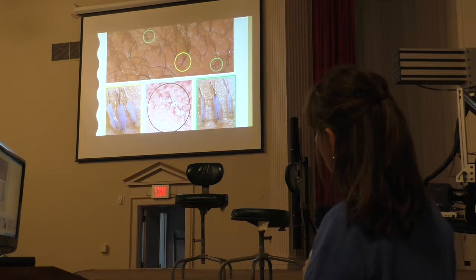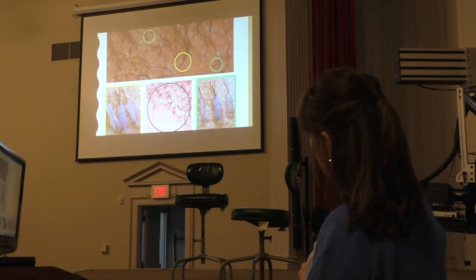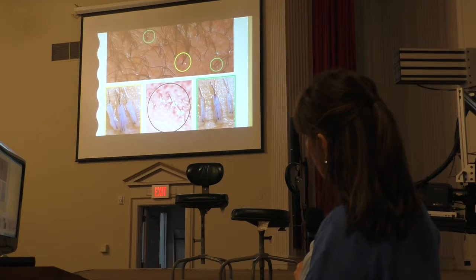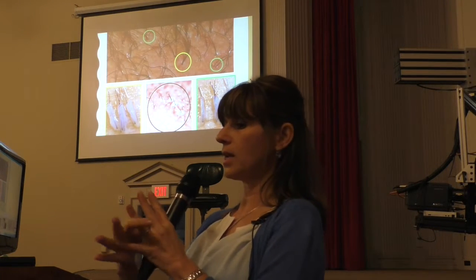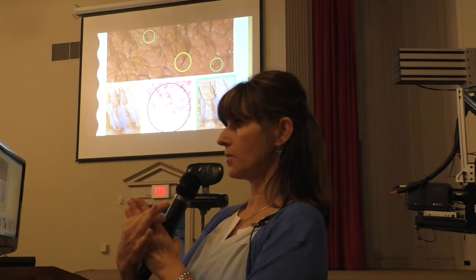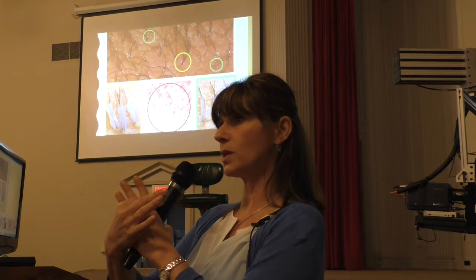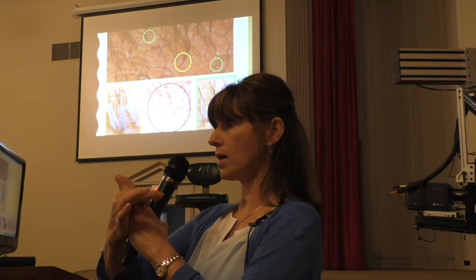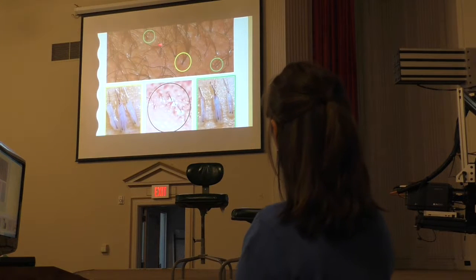If the grafts are too big in place, so if I place these grafts all in the same site, for example, I put a 1 hair graft and then there's a 2 and this is a 3 here, and I intentionally placed it close to the hairline, then what happens, you get a compression. If I put the 3 hair graft in a site that is big enough, when the hairs grow, they have a space in between them and they look natural. But if I compress them, when they grow, they have no space to grow out, so they come out and look like a clump. So this is what compression looks like.